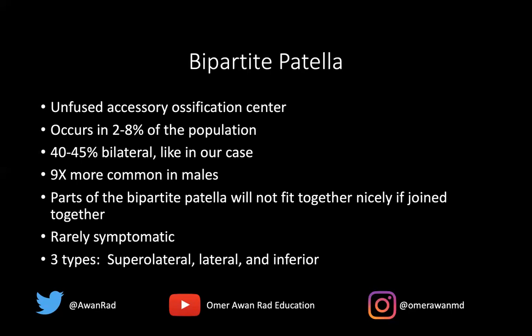Notice that there's no medial bipartite patella — that's an important consideration. Because if we see a lucency along the medial aspect of the patella, it's almost always a fracture. That has helped me a lot in my practice. When looking at radiographs, if I see a lucency along the medial aspect of the patella, I know automatically that it's likely not going to be a bipartite patella — it's going to be a fracture. Hopefully that was helpful. Thank you so much. Tune in next week for another super high yield MSK unknown case.